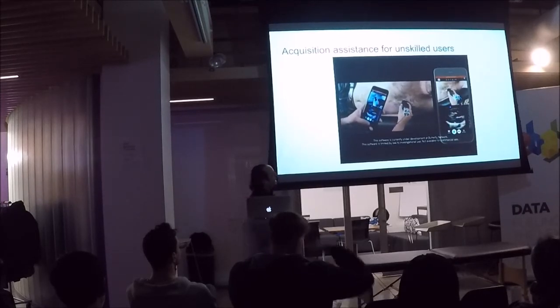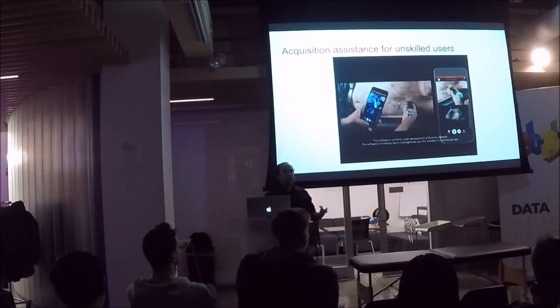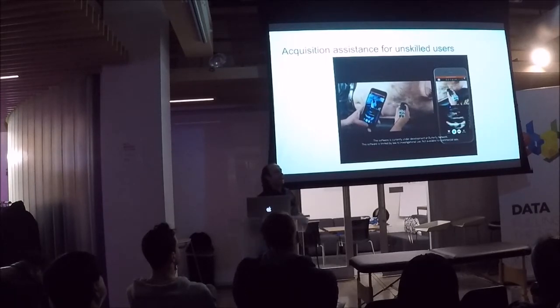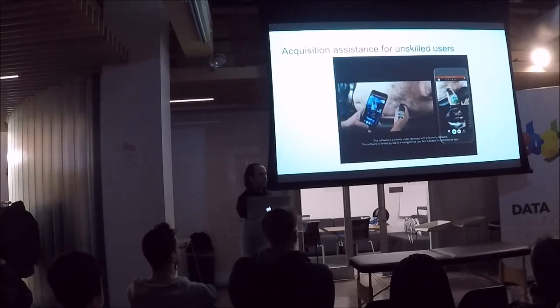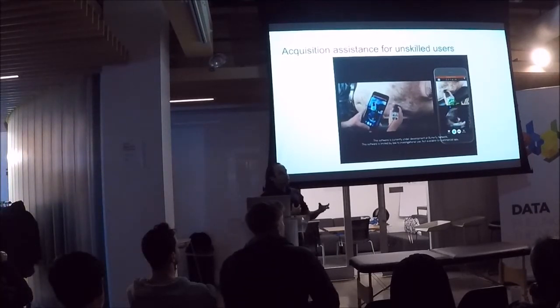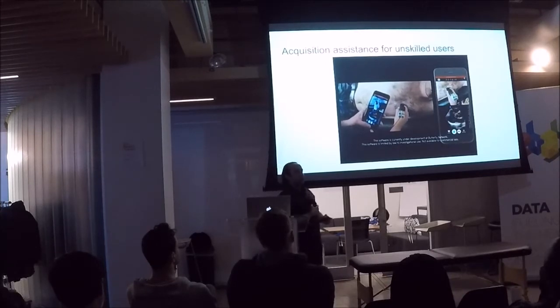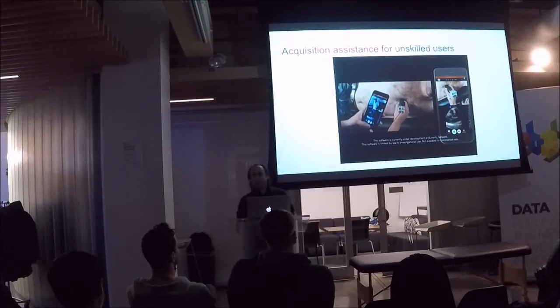So this is the sort of application where we could enable someone who's never used ultrasound before. We can put the probe into a random person's hand and have it guide them to find a location that's diagnostically relevant, at which point they can record a short video of the ultrasound content and have that be interpreted either by a teleradiologist or by an application that's running on device.